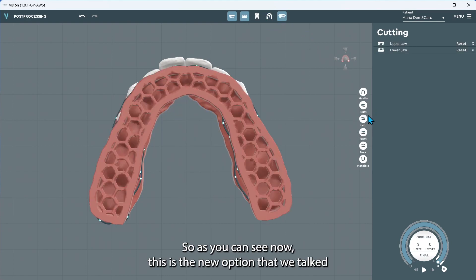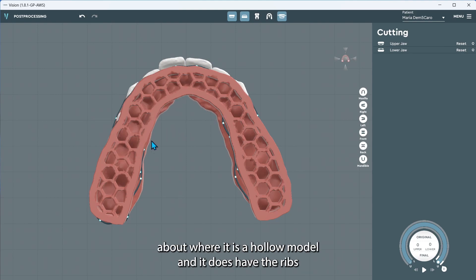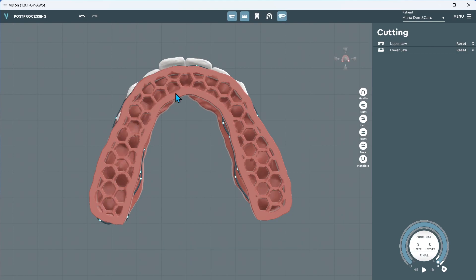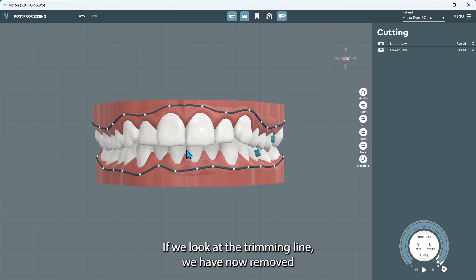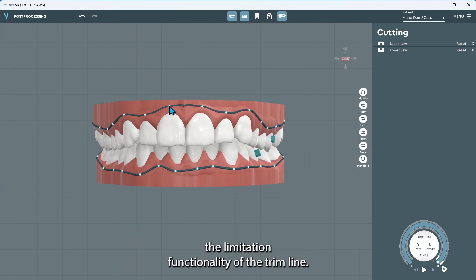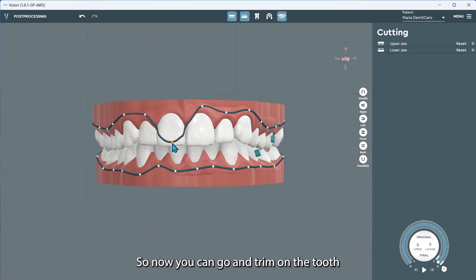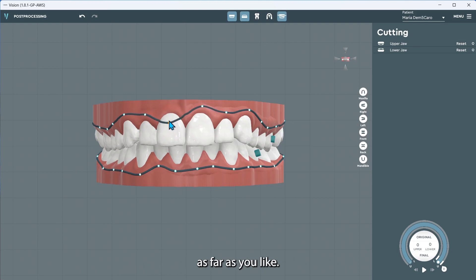And the trimming line. As you can see now, this is the new option we talked about — a hollow model that has ribs to allow the structure not to collapse under pressure. If we look at the trimming line, we have now removed the limitation functionality of the trim line, so now you can go and trim on the tooth as far as you'd like.